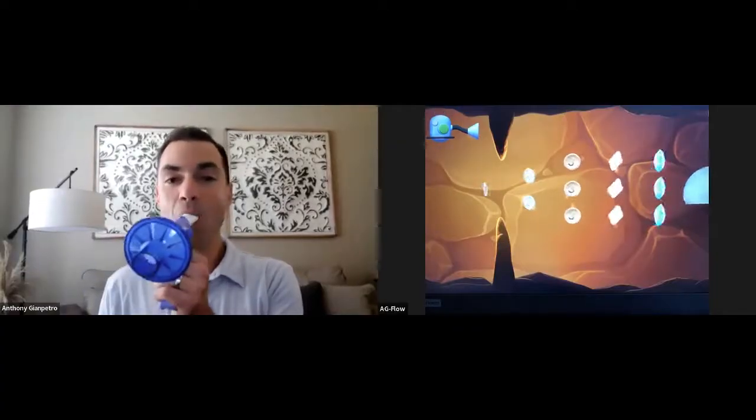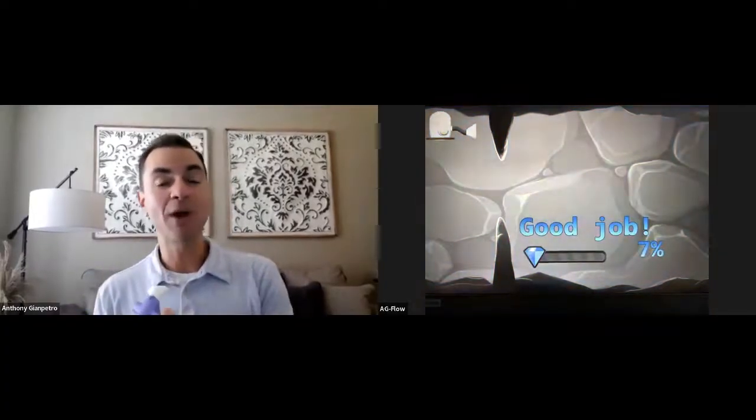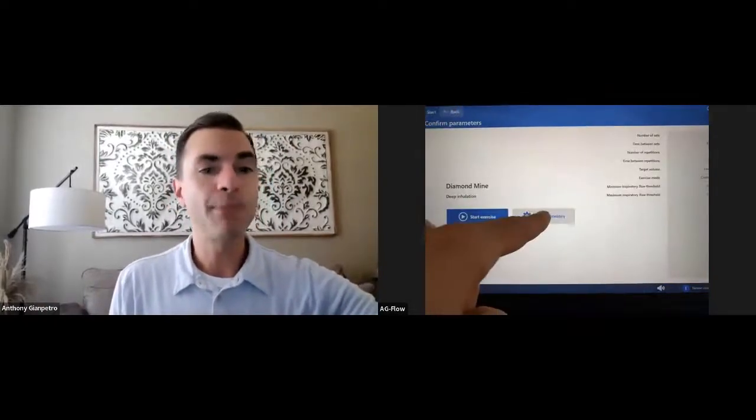Oh, it's hard. See, I went too high. Let me try again. Oh man, I'm doing it wrong. I'll try again. See, this is exactly what I want you guys to see because I have to adjust my settings. Let me show you what I mean. Because I couldn't get the task done, rather than make me stick it out, I just X out, use the escape button, go back and hit edit parameters.